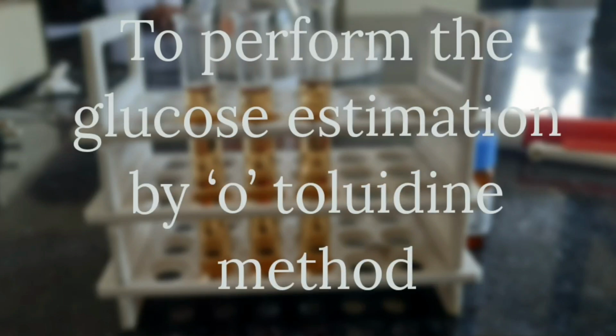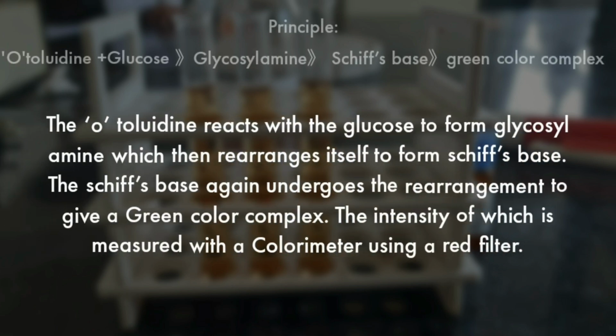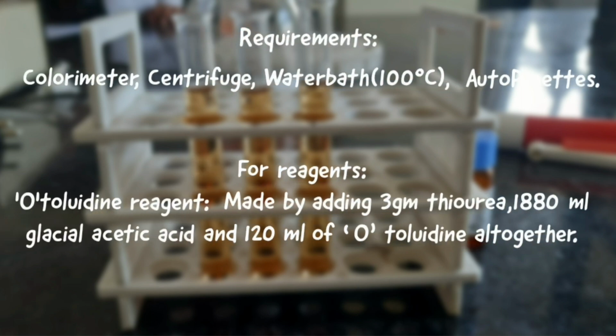To perform the glucose estimation by O-toluidine method. Principle: the O-toluidine reacts with the glucose to form glycosylamine, which then rearranges itself to form Schiff's base. The Schiff's base again undergoes the rearrangement to give a green color complex, the intensity of which is measured using a colorimeter red filter. Requirements: colorimeter, centrifuge, water bath at 100 degrees Celsius, autopipettes and O-toluidine reagent.